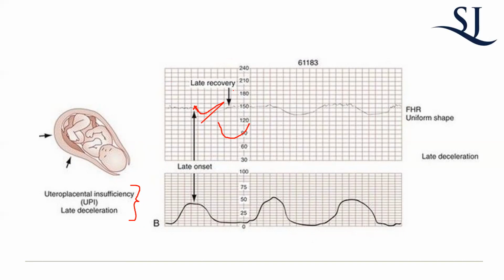So questions with this. Keep in mind, your decelerations are independent of your variability, which are independent of your baseline. You could have a good baseline and good variability, but late decelerations. And then what you'll hear providers say is, oh, well, it's okay because she has good variability. So what does that mean? That means that if you have moderate variability, the fetal status is good or reassuring anyway. So if you're having late decelerations, it's probably something that will respond to resuscitation.